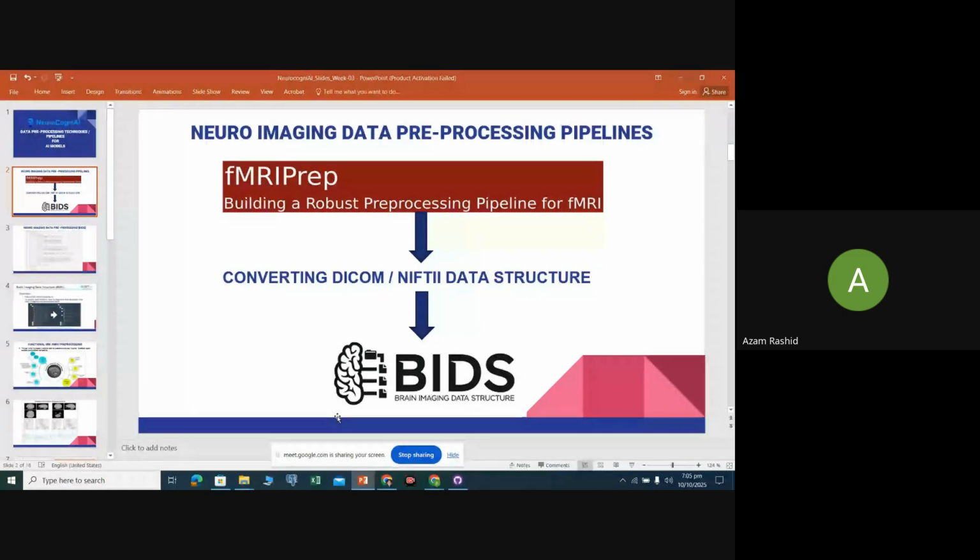All the processing tools and techniques handle NIfTI format better than DICOM. Because DICOM is multiple image files in a collective folder that give you the slice view and volume view of the MRI, but the NIfTI format is like a zip, a collective format which converts all the DICOMs into one structured file.